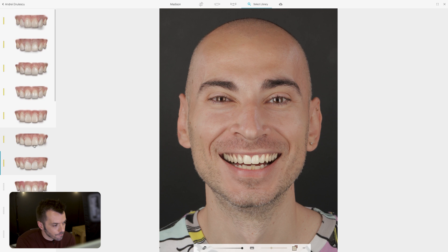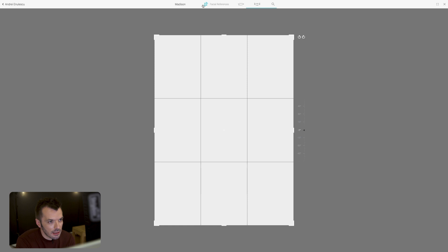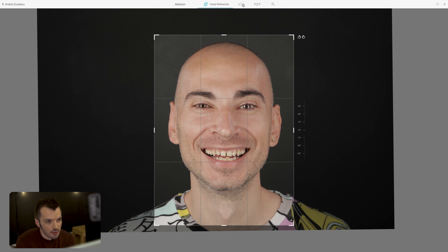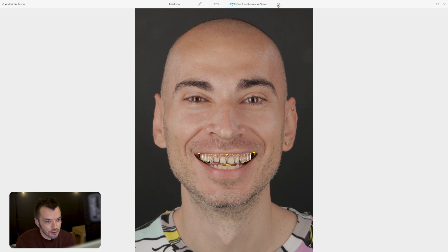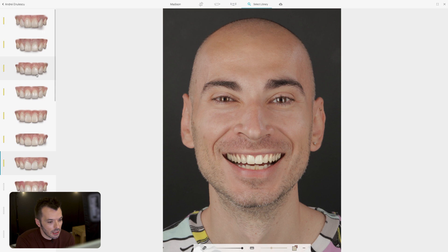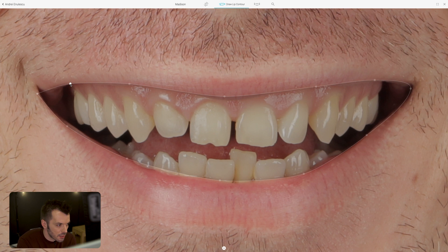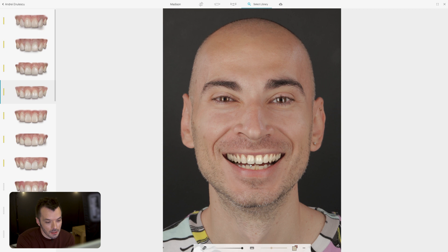Technically speaking, this is a 4-click workflow: the face, the lip (which you can adjust in this step), the restorative space, and then you're in the libraries where you can change whatever you want. At any point you can go back and change anything — for example, if the lip isn't ideal, just zoom in, adjust that area, go back to your design, and it already looks nice without having to go through all the steps again.